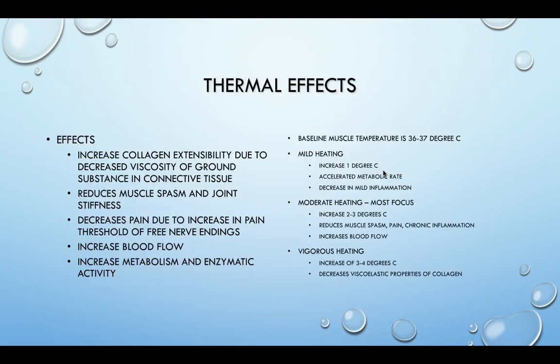So let's talk thermal effects first, because that's what we're most familiar with. That's what we talked about already in our superficial heat. So the difference here is that the ultrasound targets deeper, as well as it really selectively heats those collagen-rich tissues. So we really only get the heating in those structures that have a lot of collagen in them, which is usually what we're trying to target.